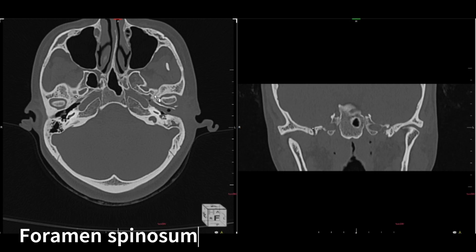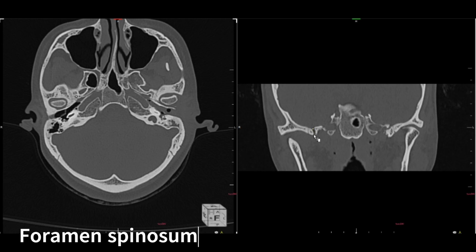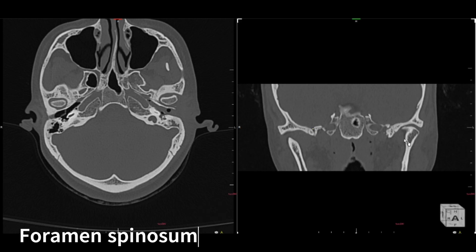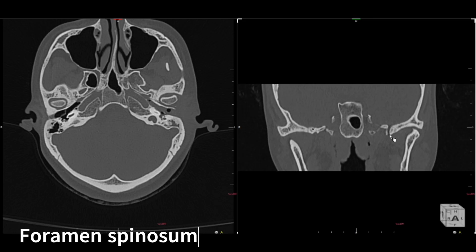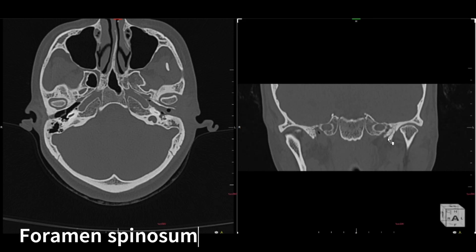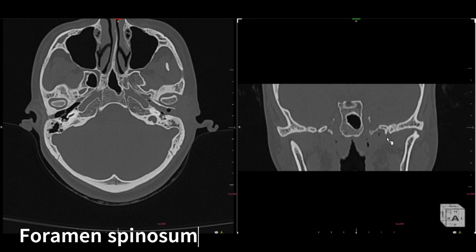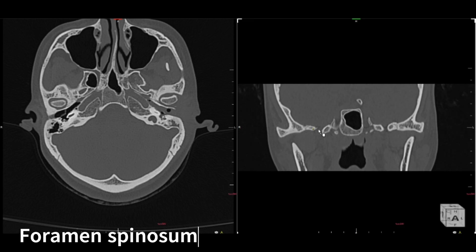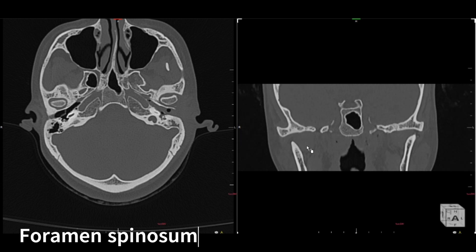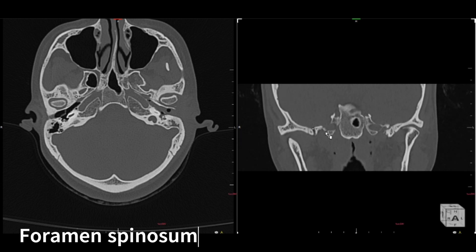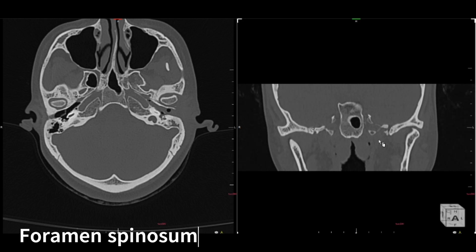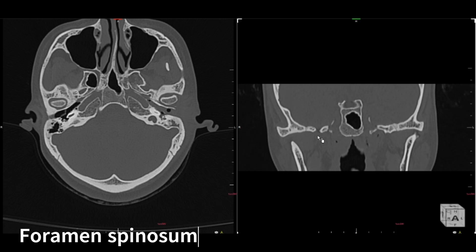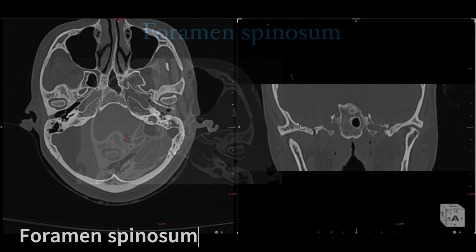Adjacent to the foramen ovale there is a small foramen — that is the foramen spinosum. It is easily located right next to the foramen ovale. On coronal images it appears as a small foramen, not as wide as the foramen ovale. Scrolling back: the foramen ovale is wide and well-visualized, and just slightly posterior is the foramen spinosum on both left and right sides. It contains the meningeal artery supplying the dura.